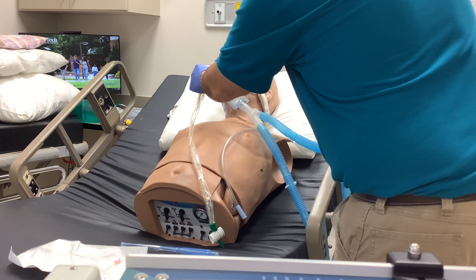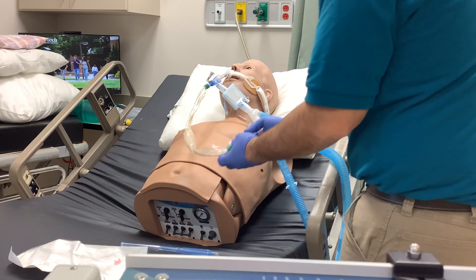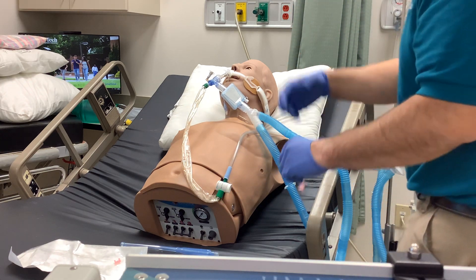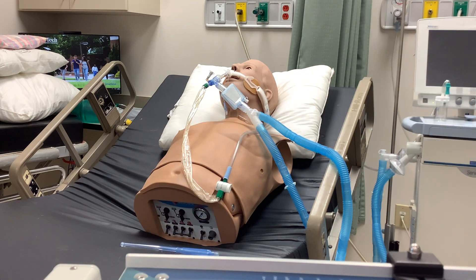Go ahead and pull this out and recap your lavage port. You can assess breath sounds, heart rate, blood pressure, and oxygenation. Hit your O2 breaths again so that you've got your post-hyperoxygenation going. And that's how you collect a sputum sample with a Lukens trap.